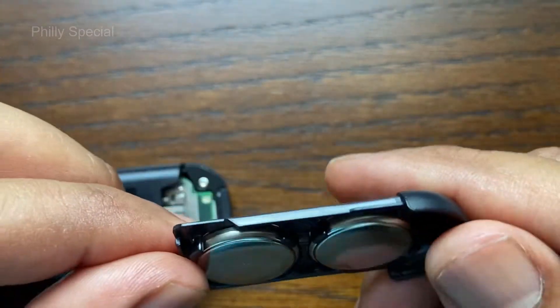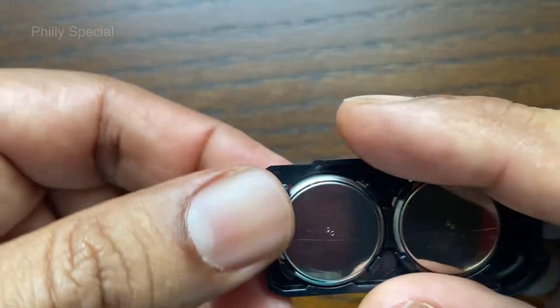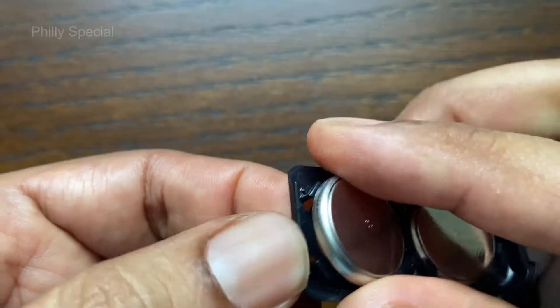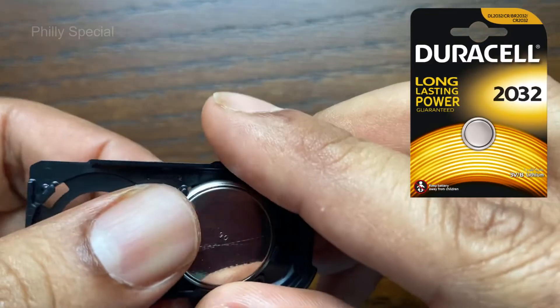The batteries can be removed by pushing them through the openings in the battery holder. Remove both of the old batteries and replace them with two 3V CR2032 or DL2032 coin cell batteries.